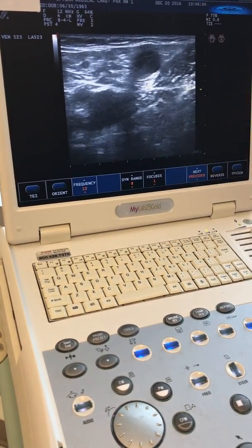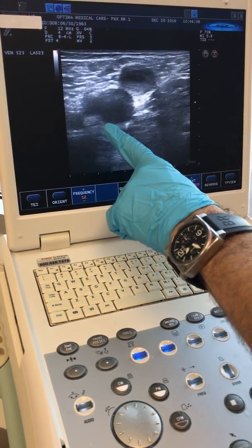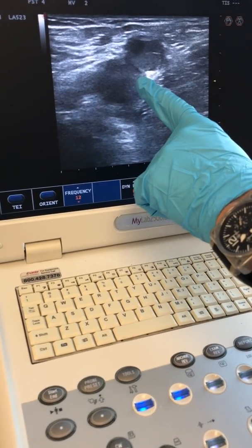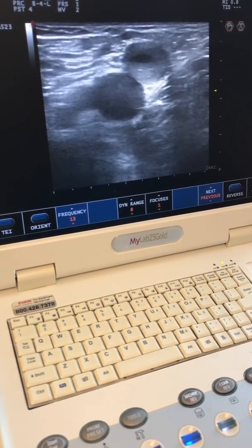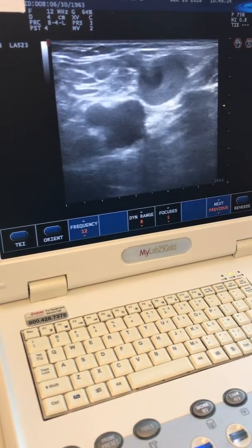This is her right great saphenous vein, it comes up inside of her thigh and it converges with her common femoral vein, which is this round circle. You can actually see a valve here and a valve right here. The blood needs to go through these valves to go up to her heart, and if these valves break, they allow the blood to come backwards. You can also see how big her great saphenous vein is here.